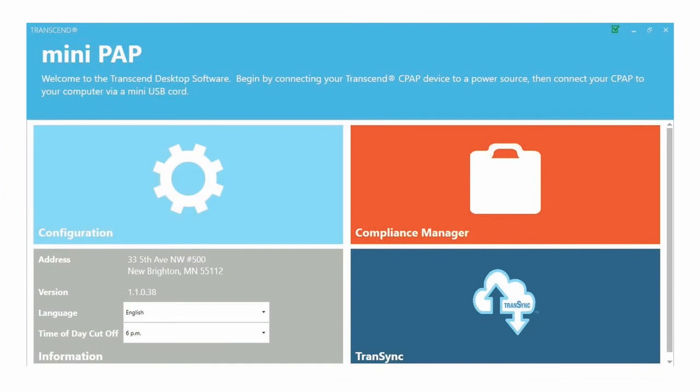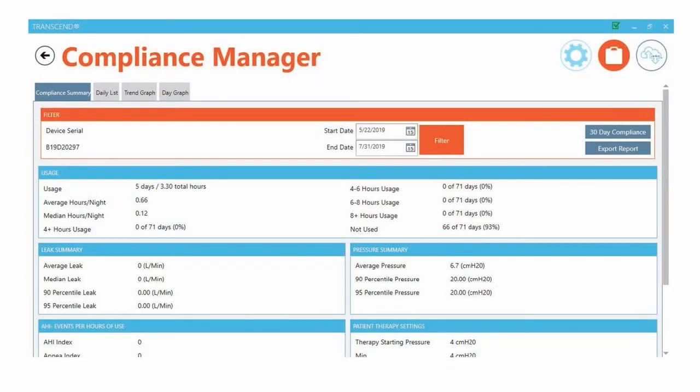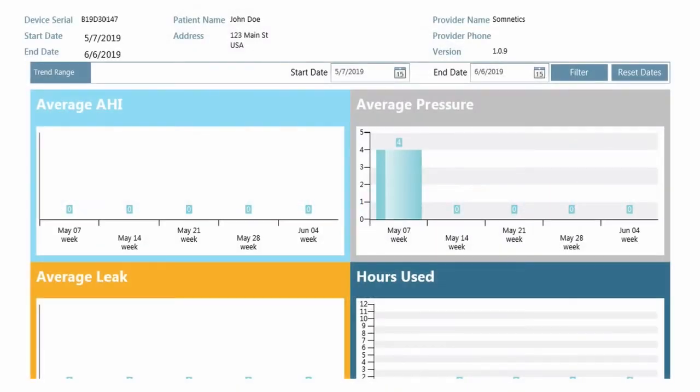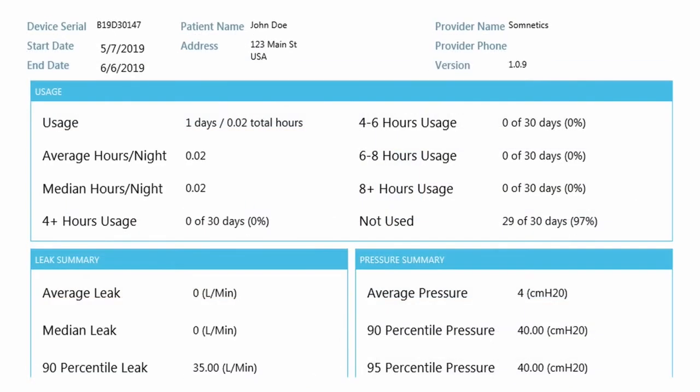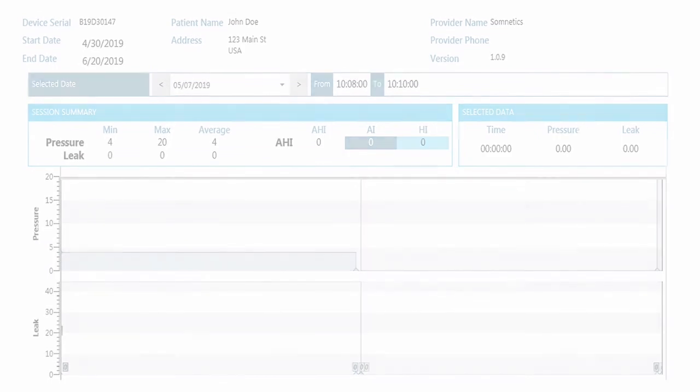The free Transcend software lets you view your compliance data and adjust the comfort features on your CPAP. Visit www.mytranscend.com/support to download the software to your computer. Connect your mini CPAP to power, then to a computer with the included mini USB cord to download compliance data or adjust your comfort settings.